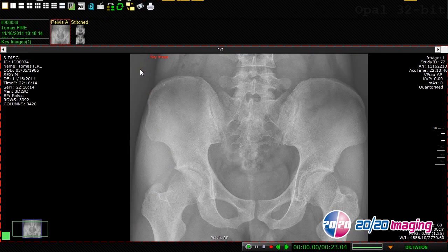The ilium analysis tool is used to analyze the AP pelvic or AP lumbopelvic image. We will be placing a series of 16 points on the image. It's important to remember that we must place these points in exact order, starting with the top of the left iliac crest, moving from left to right across the image, and finishing with the bottom of the right ischial tuberosity.